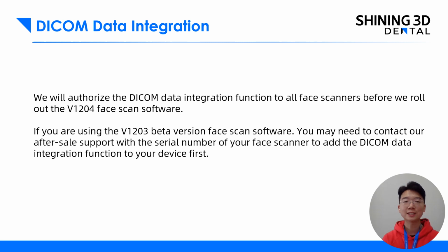As for this DICOM data integration function, we will authorize the DICOM data integration function to all face scanners before we roll out the version 1.2.04 face scan software. So if you are using the version 1.2.03, the beta version FaceScan software, you may need to contact our after-sales support with the serial number of your face scanner so that we can add the DICOM data integration function to your device first.